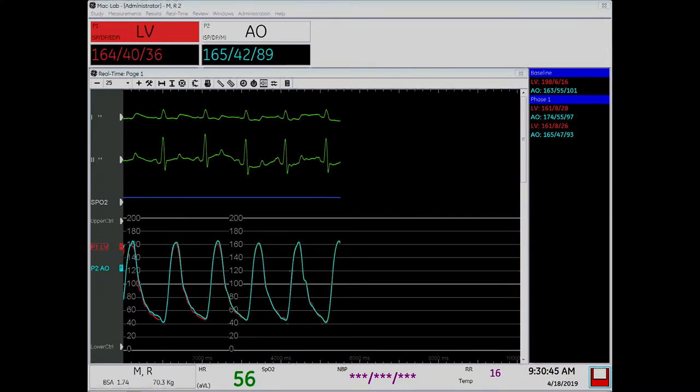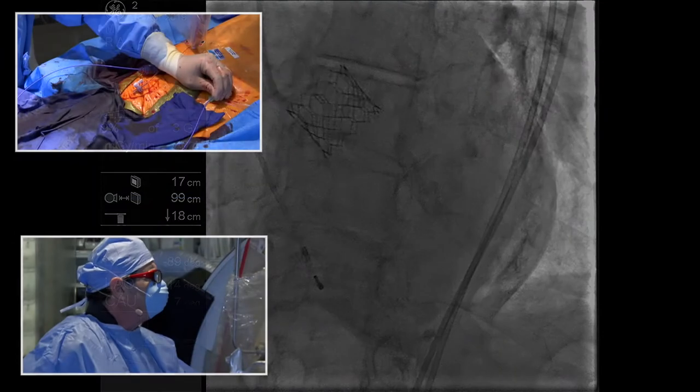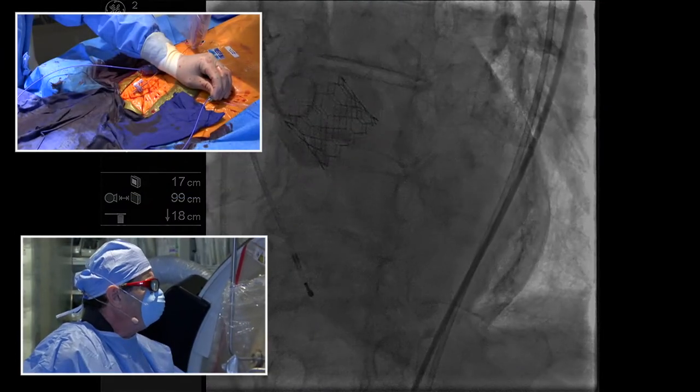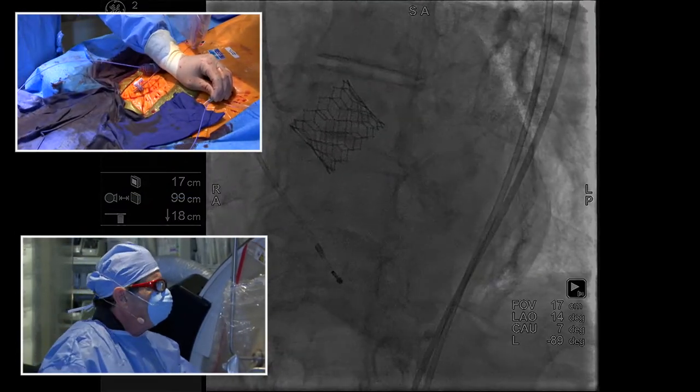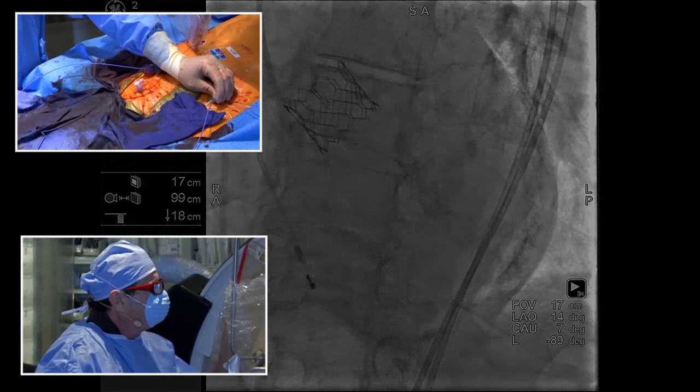Okay, and here we go. We're on 2. Let's go on 1 so we can see it better. Here we go. Inject. Go. Yeah, it's pretty good. Clears with one beat and doesn't go to the ventricle.